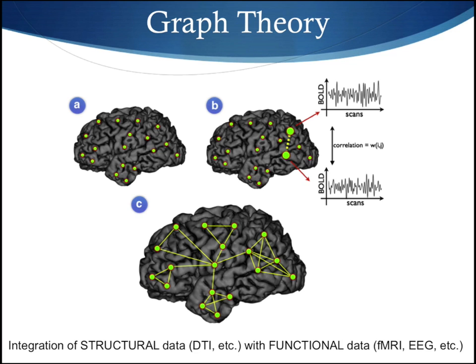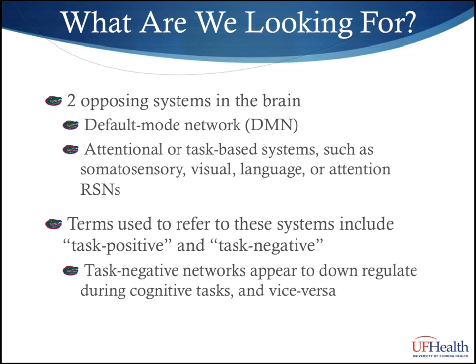If a particular white matter bundle was injured, the brain may have reorganized the functionality, giving a normal or near normal appearance on functional MRI, despite the fact that the structural data is abnormal. The other point is that DTI cannot give us information about second-order neurons, so connections we establish by DTI are only first-order synapses. Therefore, we cannot determine a functional connection between two areas in which there are not direct structural connections.